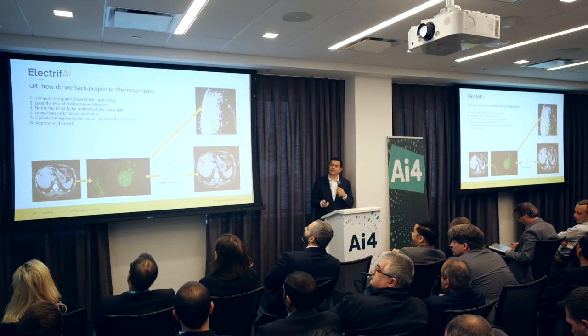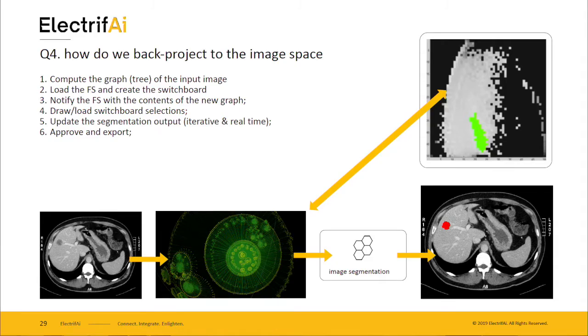And then when there is a new case thrown in, then we have all this accumulated knowledge. So what we will do is, in the absence of interaction in this image, we will actually have all the possible objects extracted out of that because they are represented into the graph, and they will be projected into the feature space. And those that actually coincide with that area will be extracted, segmented, and you will get the automatic result, which looks like this. So you throw in this, you get that as an output.